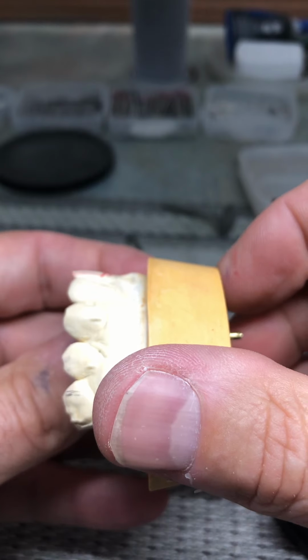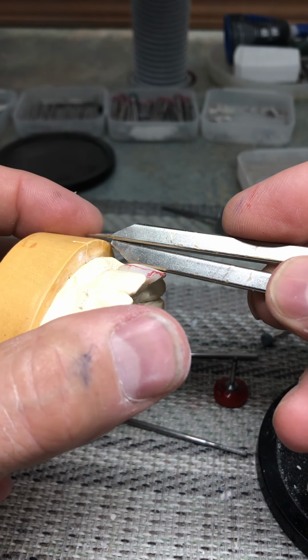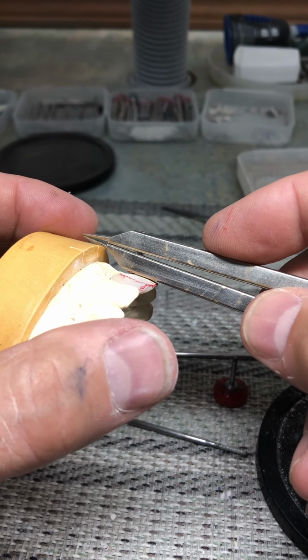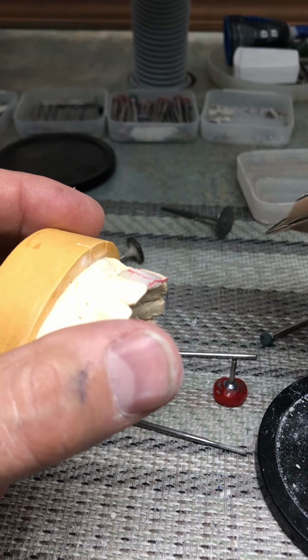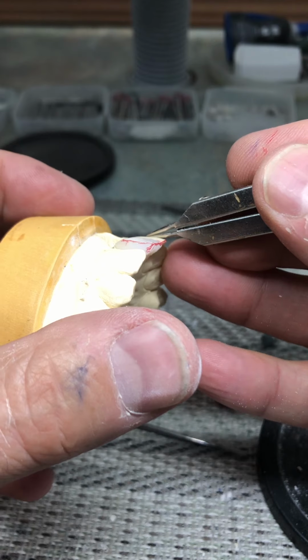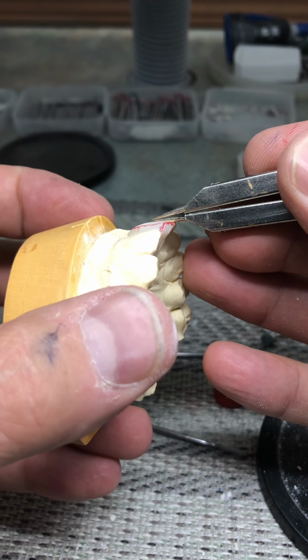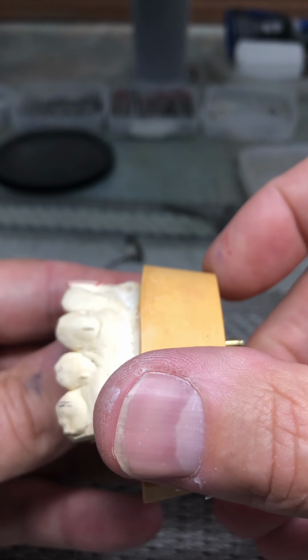I also look at the profile of this tooth. Usually the general goals are to keep the labial surface of the maxillary anteriors in line with the lip closure path. So there's usually three planes. On this tooth it's very subtle, but there's a gingival plane, a central plane, and an incisal plane, but there isn't much difference between all three, but it's definitely there. So I'm pretty close to those contours now.